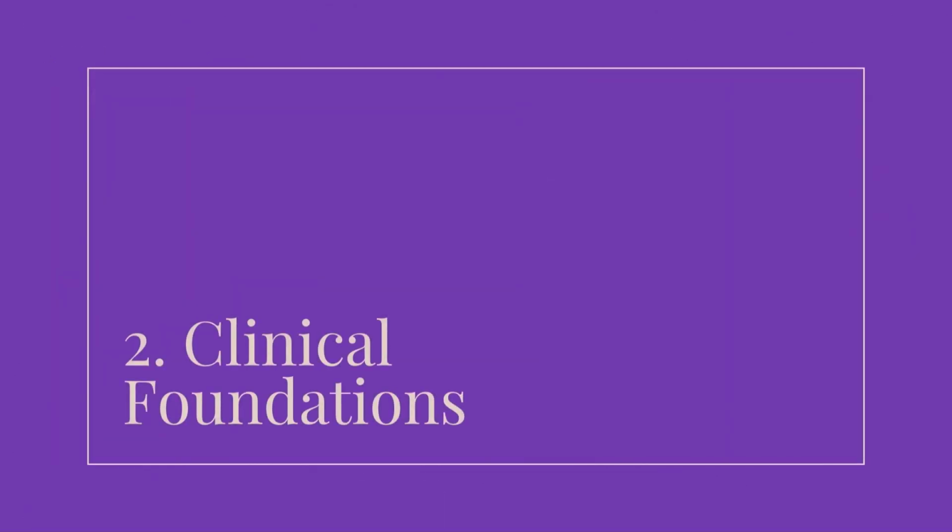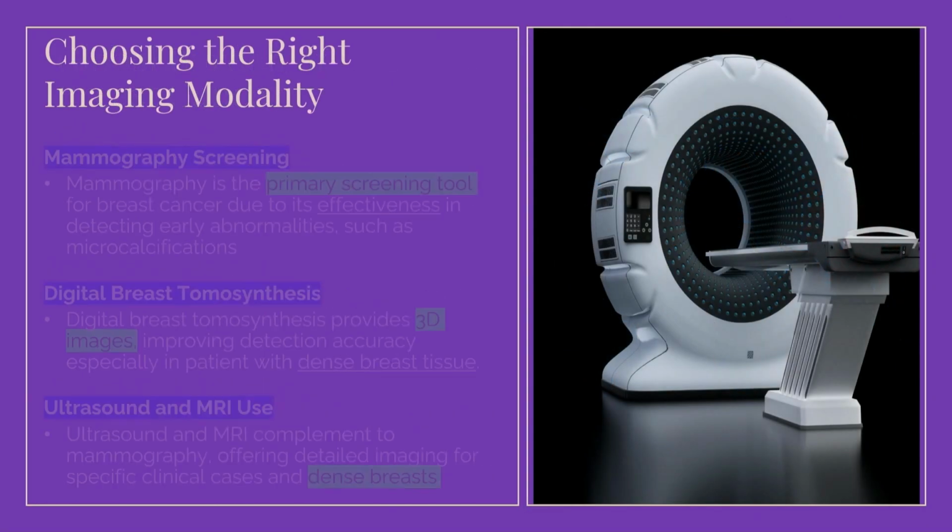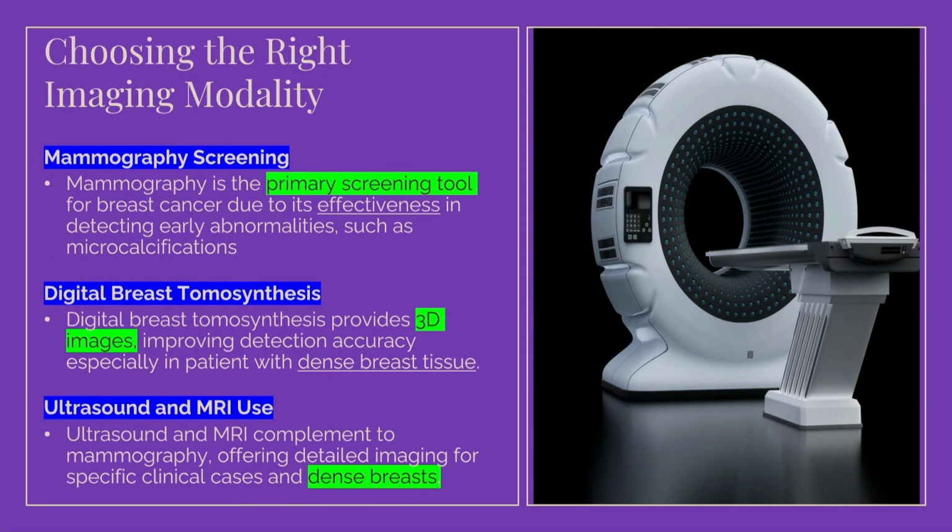So clinical foundations, I can skip this because our previous speakers already touched on this: why screening mammography is very important. What I highlight here is the microcalcifications, and only mammography can pick up microcalcifications. Ultrasound, CT, MRI have a limited role. And that's why in recent years, we have the 3D models of mammography machines, which can serve to tackle the problem for those women who have dense breasts.